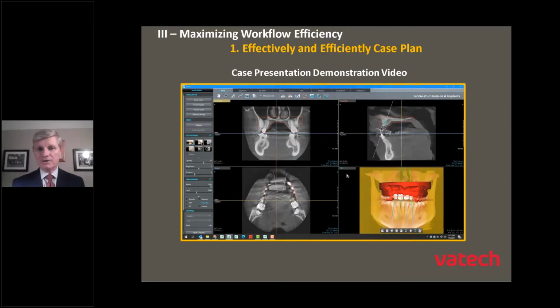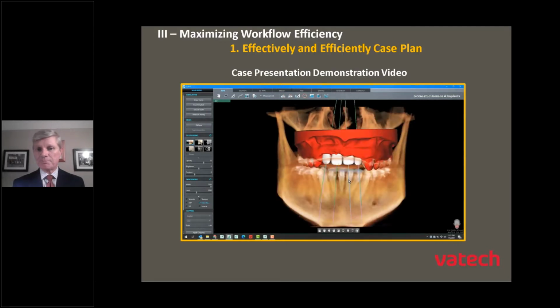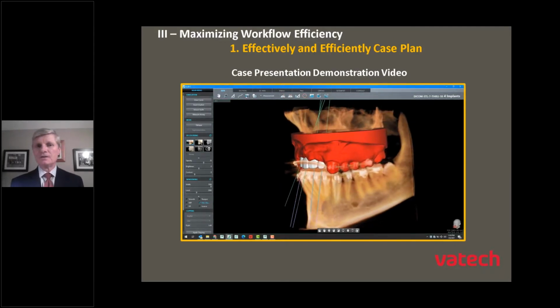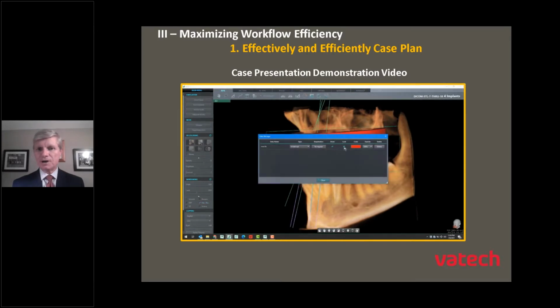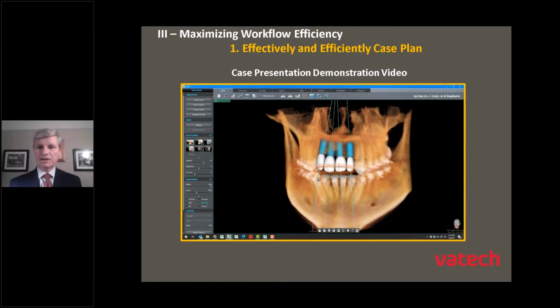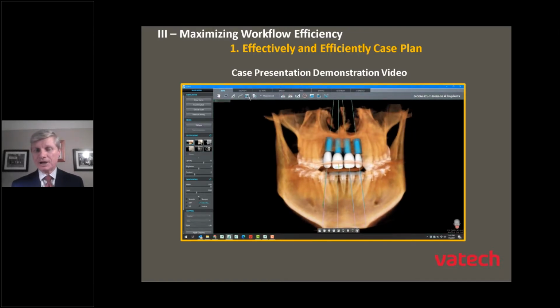So what I did just now was click on it once, and I captured that entire MPR view. I hit the Enter key to maximize that 3D rendering. I made it kind of an oblique view, looking at it from this angle with the stone model in place. I clicked on the camera again, and now I'm going to right-click. I'm going to hide this stone model that I've scanned. So looking at just the dentition and my virtual implants. I'll rotate it back around again, and let's go ahead and I'll grab this now a third image of my anatomy, which I'll then use for more case presentation.